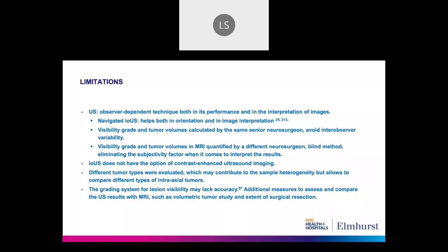And even if the grading system for visibility that we used is the most refined that we have at the moment, it's still a very subjective technique. But we also measured the volume of the tumors, and the extent of surgical resection will give us more accurate data.